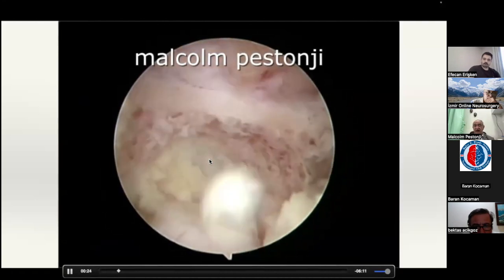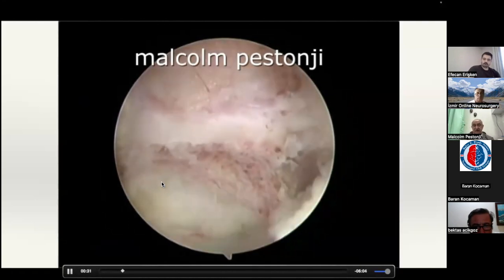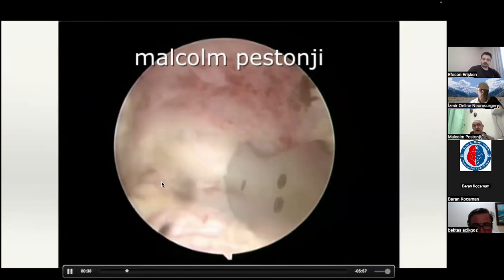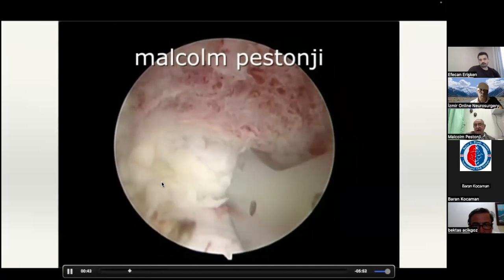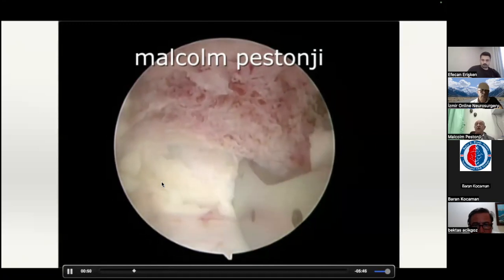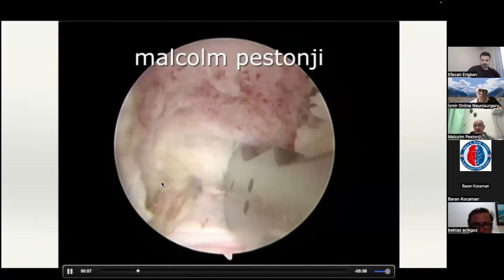Then I will identify my superior articular process, which I see is white over here. And then I will plan my osteotomy. So now I'm bringing in a J-shaped hockey stick osteotome, which is part of the chisel set. And now you see how I'm banging it across until this black hole will enter inside. Now you must be careful in not overcutting, because if you take out too big a piece, you won't be able to pull it in. If you cut too small a piece, you are not going to get the relief you want. So you need to judge properly.